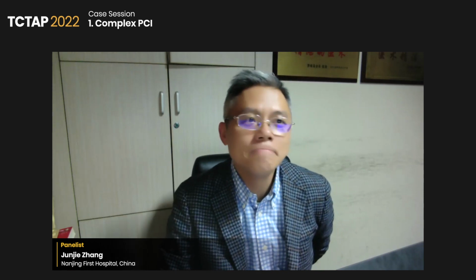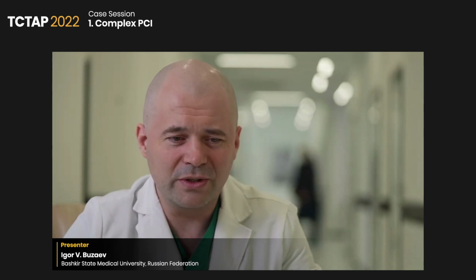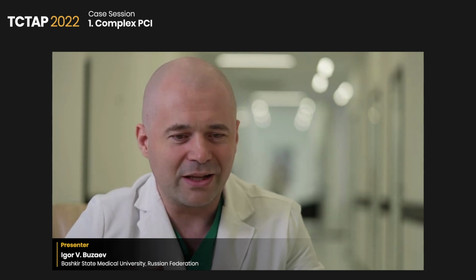Thank you. It is a great question. First of all, we don't exclude TE during this procedure. It helps us to move with our devices, with our instruments, because interventional cardiologists look at the fluoroscopy screen first. We cannot open the device on TE only.